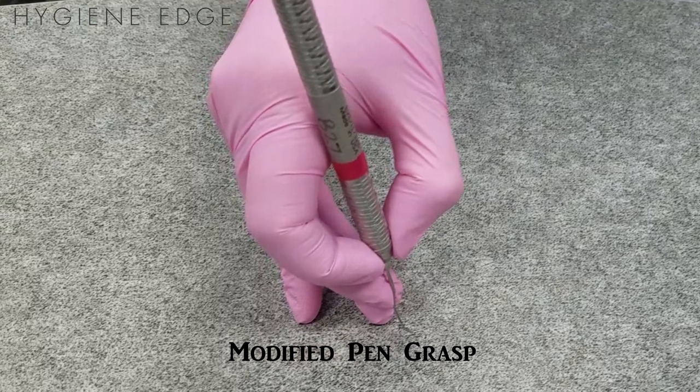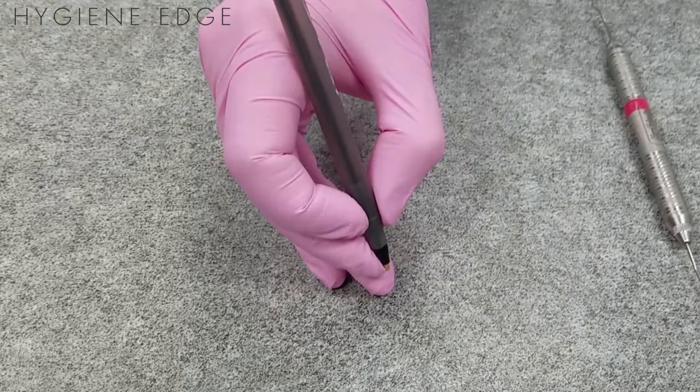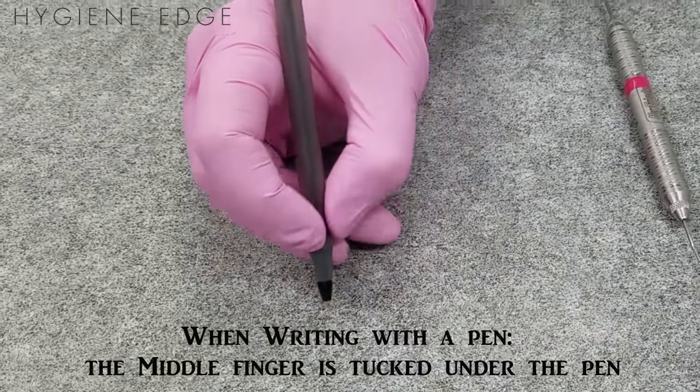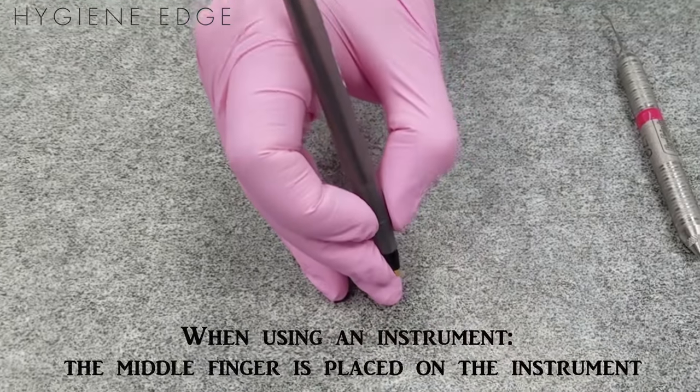You hold all instruments while providing treatment with a modified pen grasp to increase control and reduce musculoskeletal issues. It is called a modified pen grasp because it's similar to holding a pen while writing, with a few modifications.